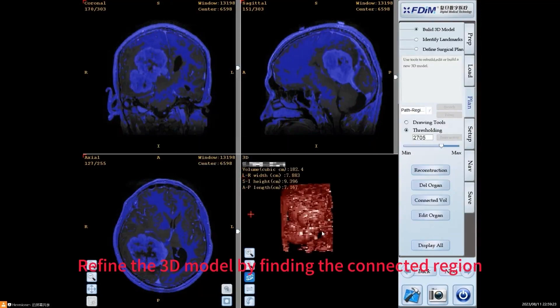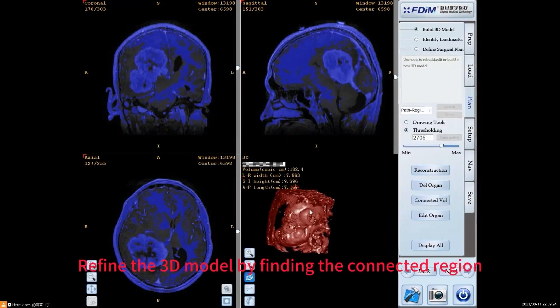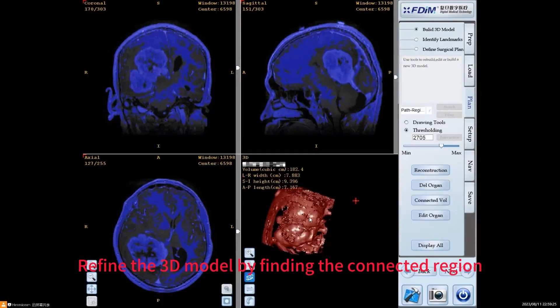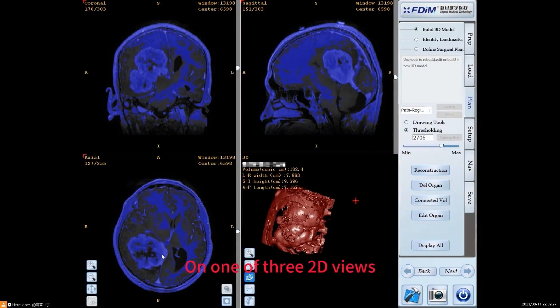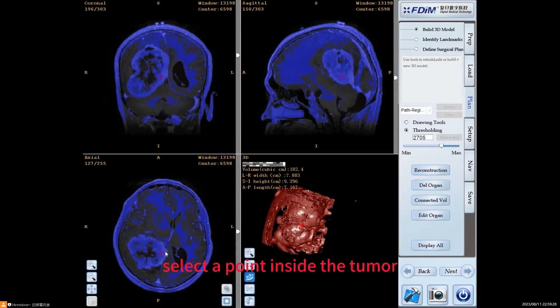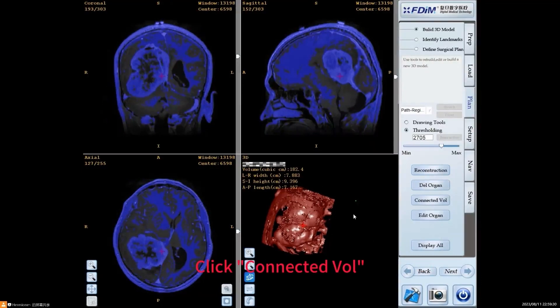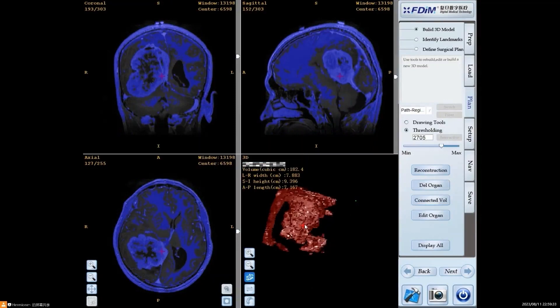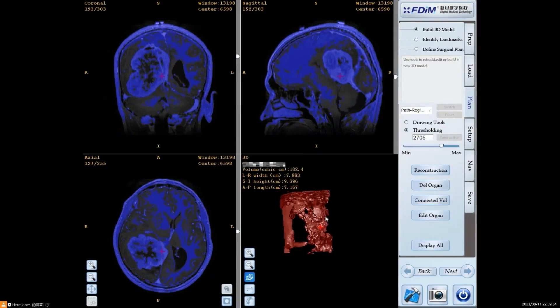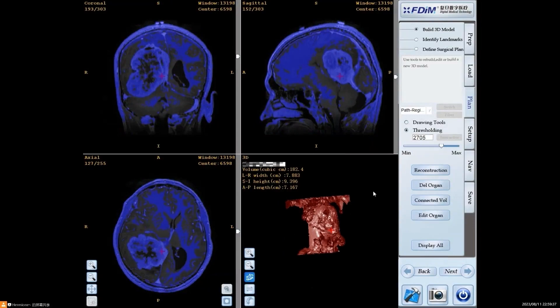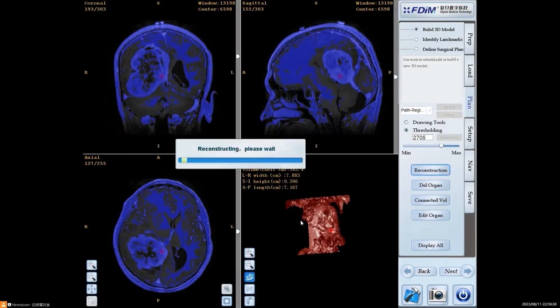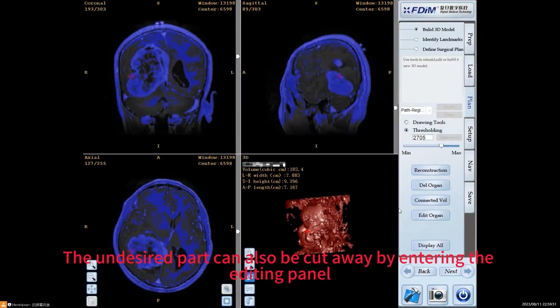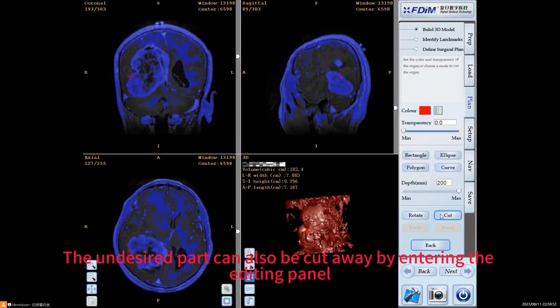Refine the 3D model by finding the connected region. On one of the three 2D views, select a point inside the tumor. Click Connected Vol. The undesired part can also be cut away by entering the editing panel.